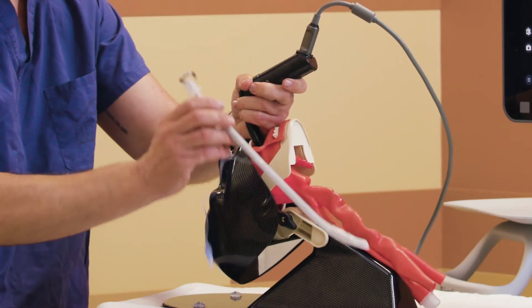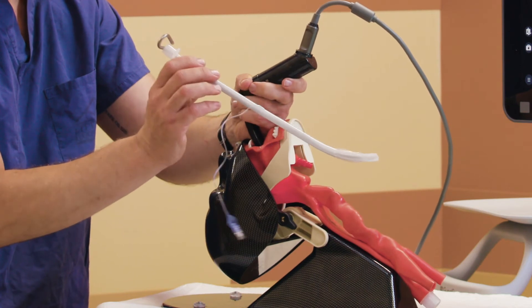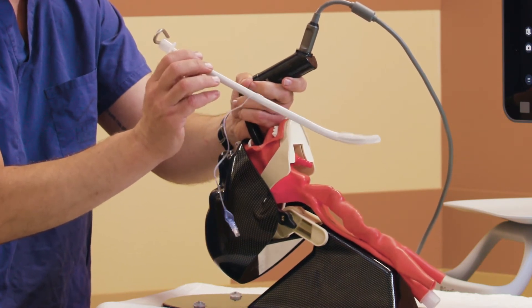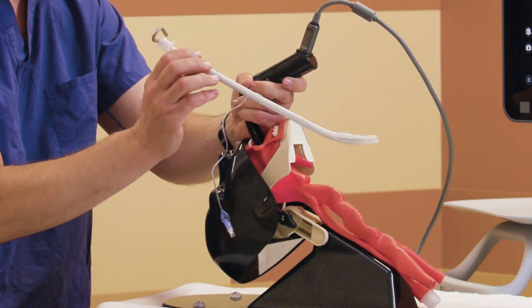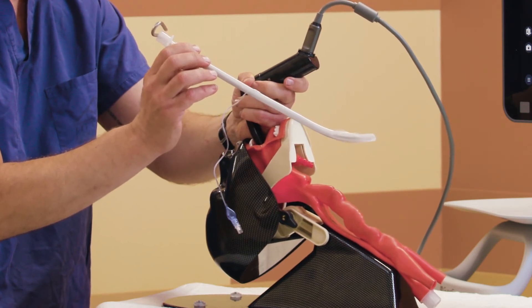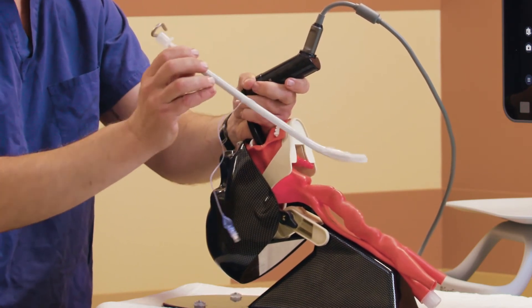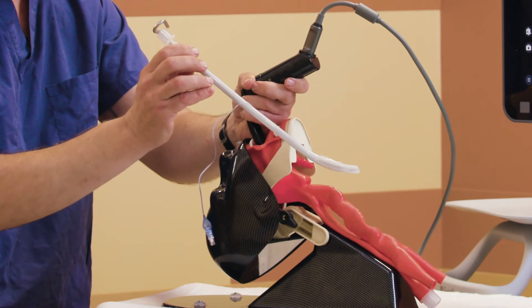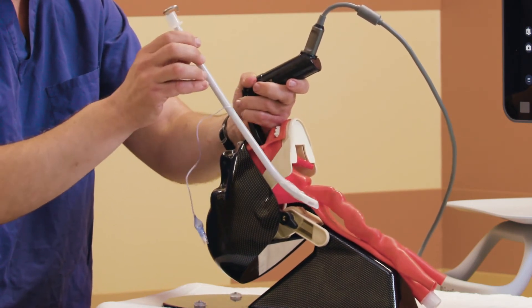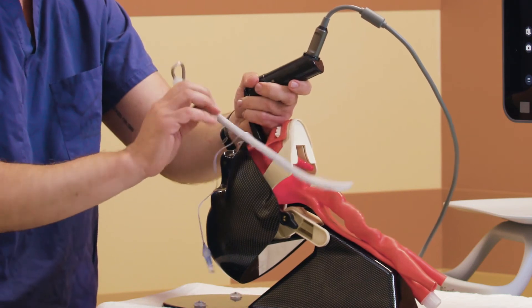I'm now going to take my straight-to-cuff styleted tube and notice the bend angle here is very slight — it's only about 30 to 35 degrees. This is going to pivot and it has to pivot into the right corner of the mouth where there is room to pivot backwards.